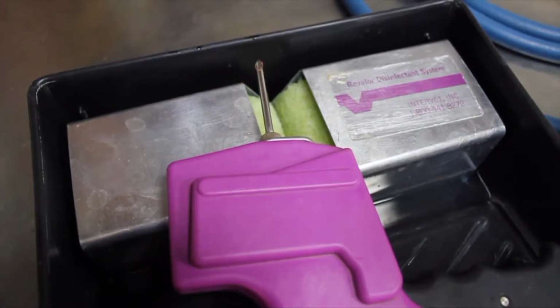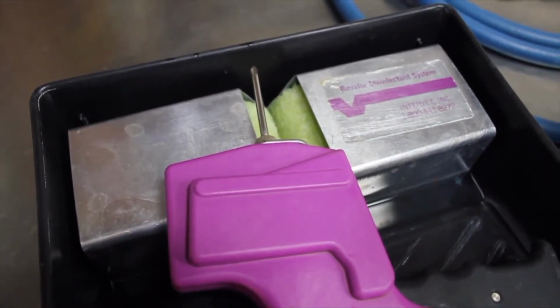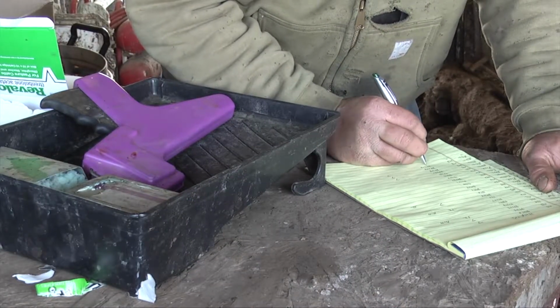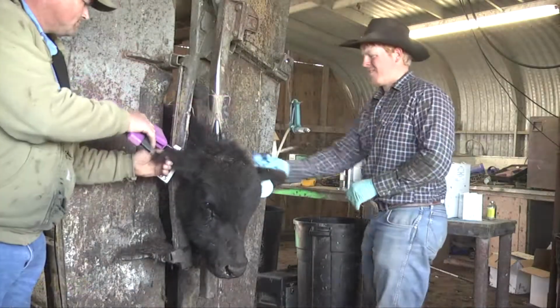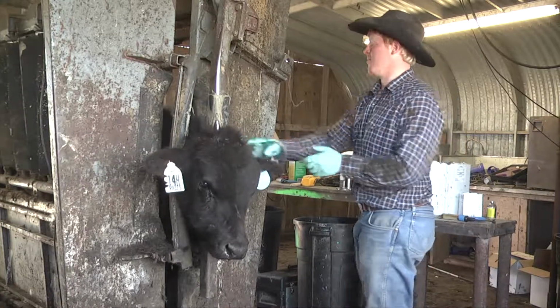And they are big bore needles that the implant actually slides through the inside of. So what we want to have happen is we want to make sure that we have a very sharp, clean, disinfected needle before we even start. If we see any burrs, anything of that nature, we want to make sure that's taken off. They're cheap, they're readily available, they come in the implant box. Just replace the needle. That's the biggest thing, and have extras on hand, because accidents happen.